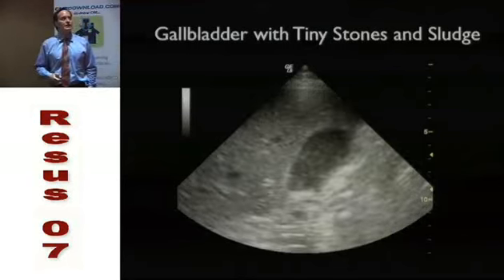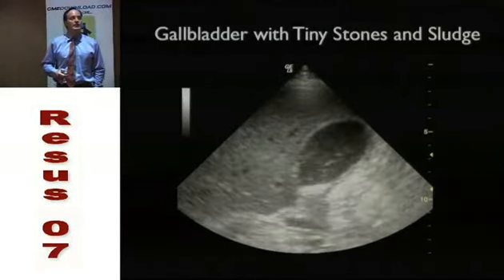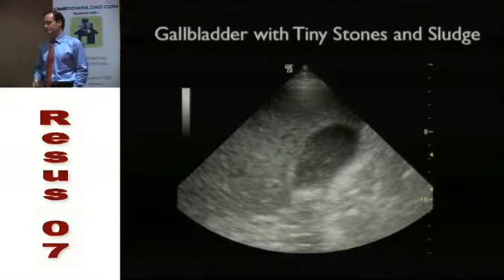And here's one just showing the microlithiasis of small stones. And this patient actually had gallstone pancreatitis, so this was enough to cause problems for our patient.